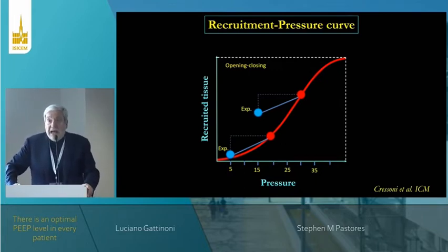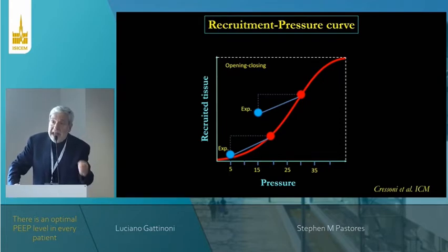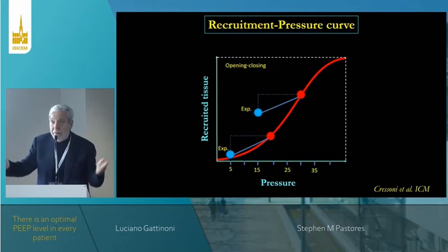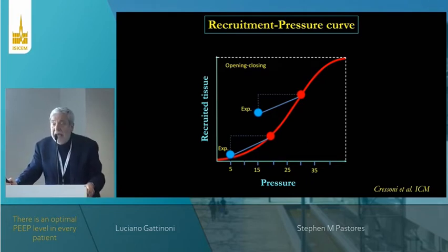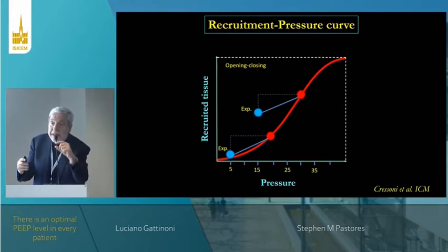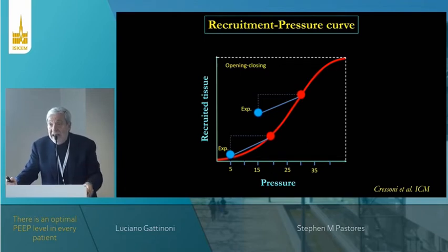you have to keep the lung at least at 23, 25 centimeters of water pressure in the general population. At this pressure, you just have some problem with the hemodynamic, and not just to maintain the pressure. You can do it. You give 3 liters of water, and you give some cardioactive drug, and say, what is the problem with hemodynamics? I control the hemodynamics. Unfortunately, the patient gained 3 kilos, and as soon as you decrease the PEEP by 2 centimeters of water, the lung will start to collapse because you make atelectasis, because you increase the edema of the lung.